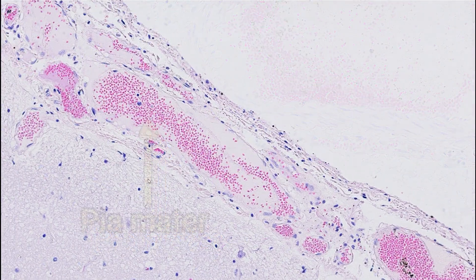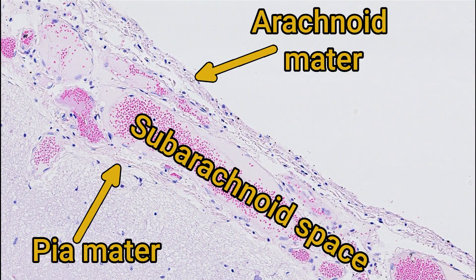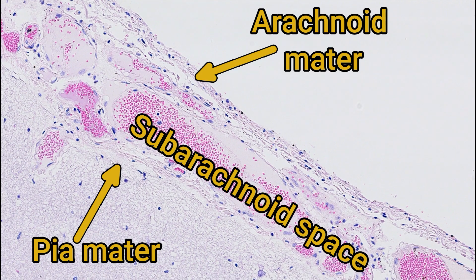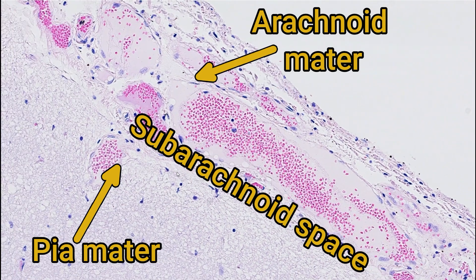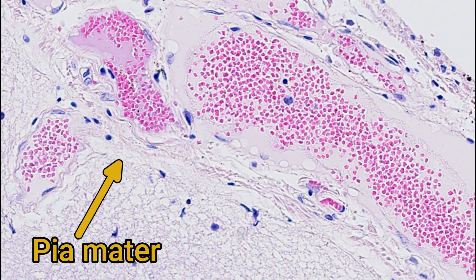Perhaps over here it's a little bit more convincing: we have collagen of the arachnoid mater with all of these nuclei being fibrocytes, then the subarachnoid space filled with blood vessels, and then just another thin little bit of collagen here. You can just make out the wavy fibers with a fibrocyte there for example.